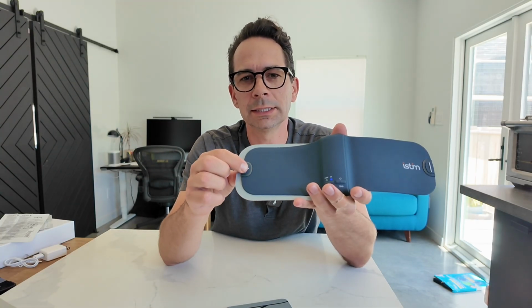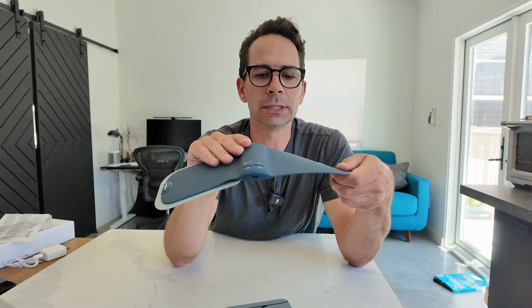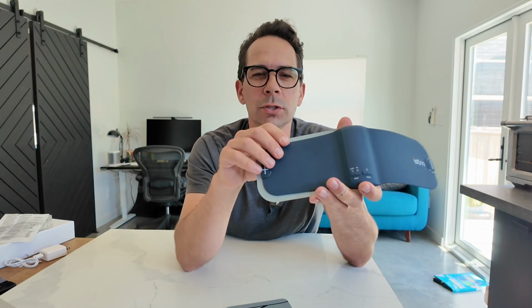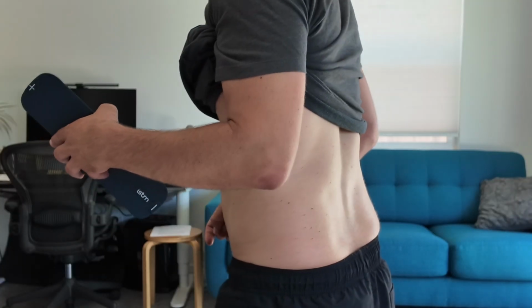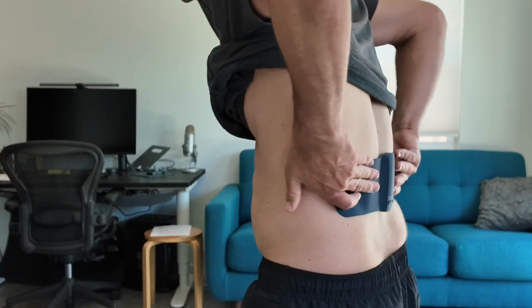There is a plus on this side, so if you want to increase the TENS intensity or decrease it here, you can do that. And then the heat has a low and a high, and to turn either of these off, you just hold it down for 3 seconds and it will turn that off, and it will auto turn off after 20 minutes.